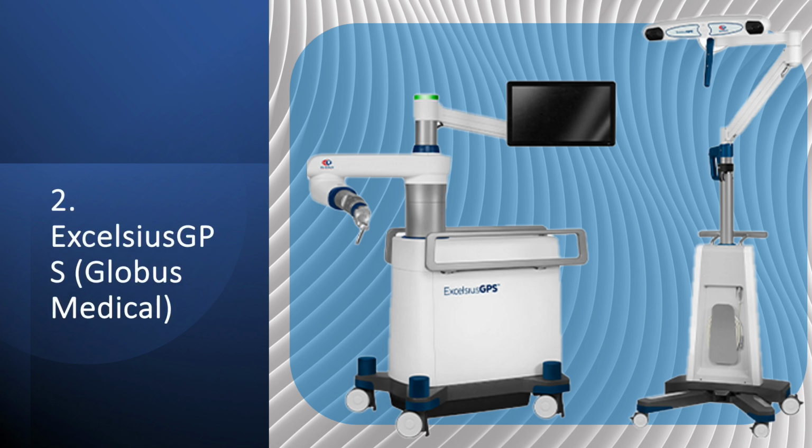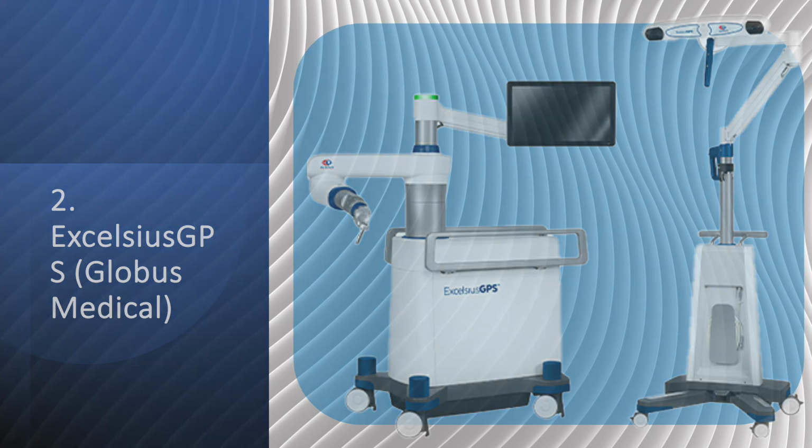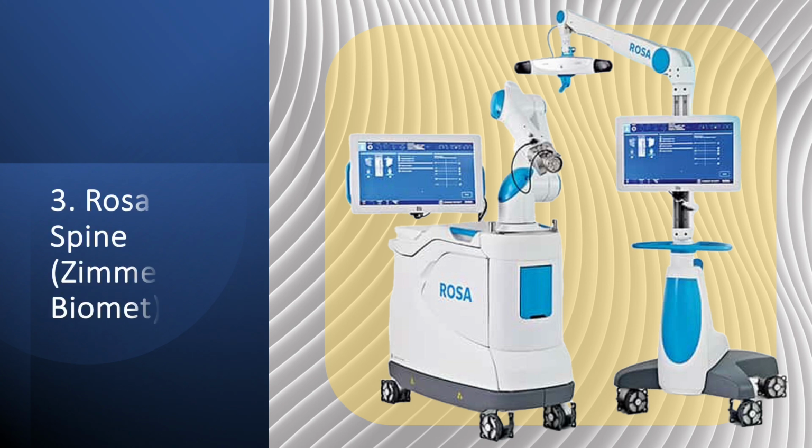The second most popular spine robot is the Excelsius GPS by Globus Medical, which integrates a robotic arm with navigation. We will cover more details in a separate video. ROSA One Spine combines robotics and navigation with real-time patient tracking, assisting surgeons in performing minimally invasive and complex thoracolumbar spine procedures.